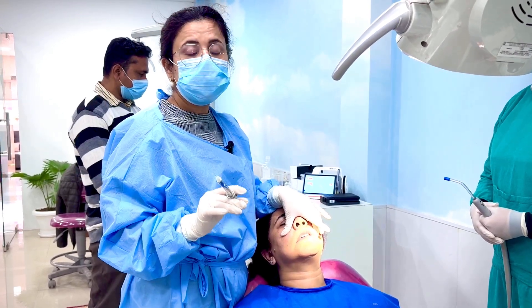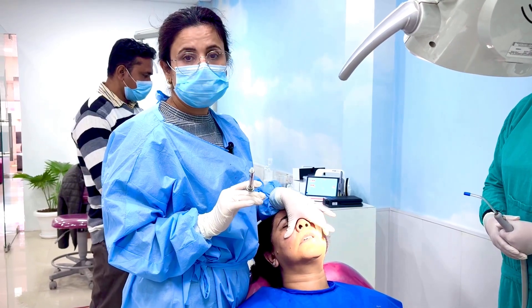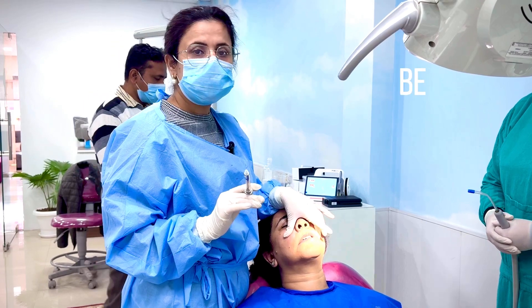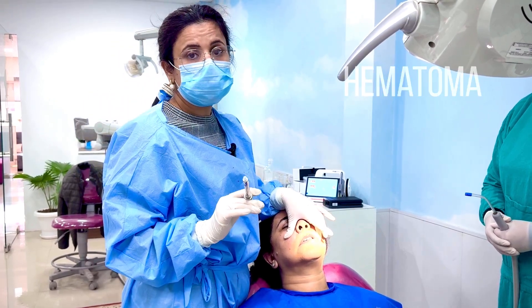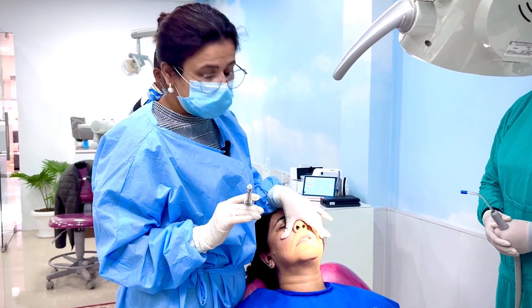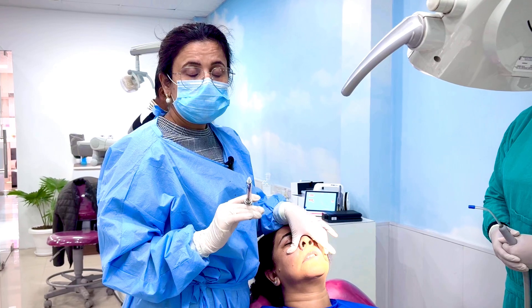The second point is to always press beneath the zygomatic buttress so that in case there is any bleeding, it will be stopped there only and hematoma formation will be prevented.